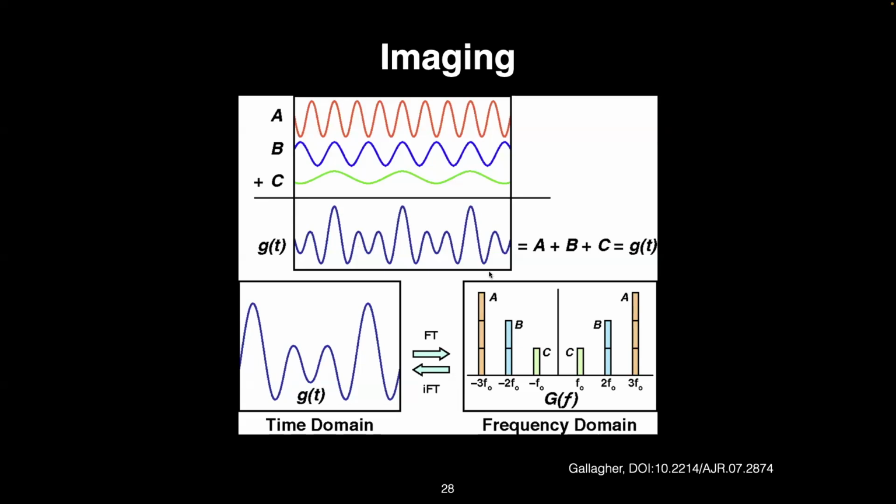But it turns out there's a very convenient branch of math built for taking waveforms like this, which are known to have these specific frequency components, and breaking them back down so that we can get the amplitude of each component. This is basically the math that we're doing with MR excitation and detection. This is essentially Fourier analysis.